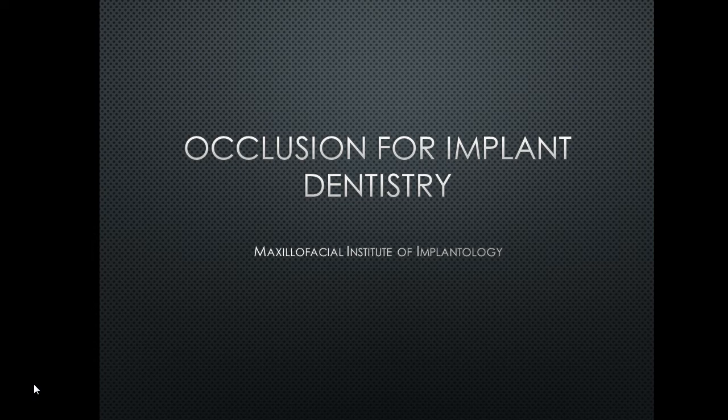Either it would be a screw-retained, cement-retained, bar, clipped, or porcelain-fused restoration, and all of those make a difference in the surgical way you're going to place your implants, or have some type of contributing factor. But being a general dentist, since you're going to restore it, it gives you a nice continuation, because you can have one complete thought in your head when you're actually placing the implant and being able to restore it, and truly implant it that way.